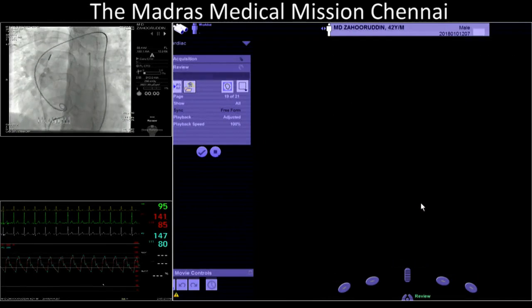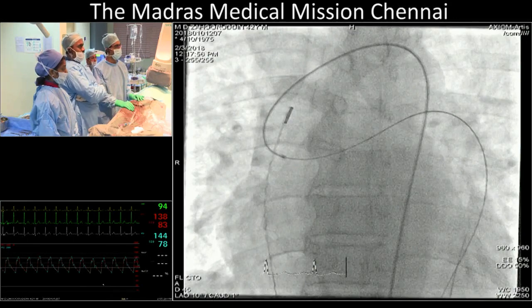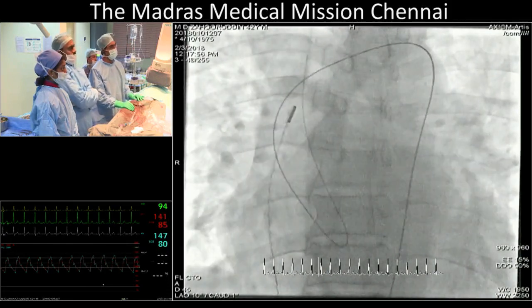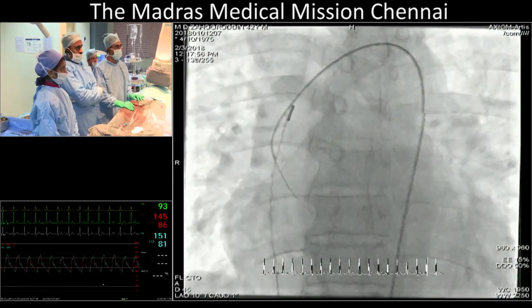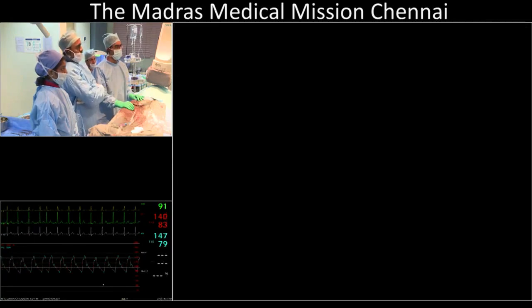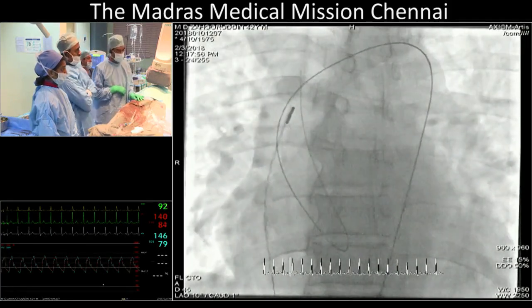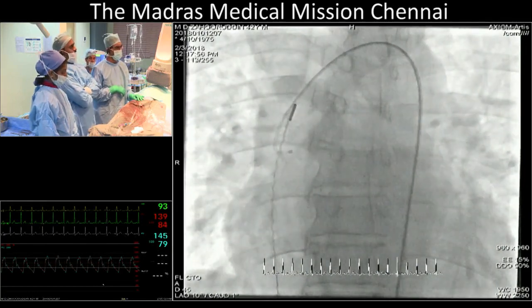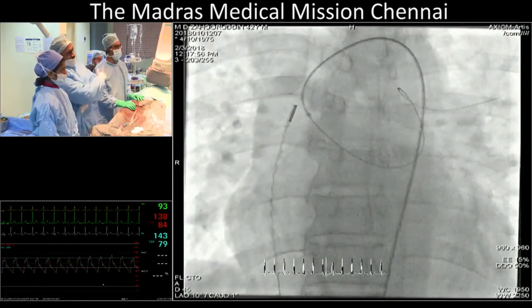We took an aortic catheter and dropped a wire into the pulmonary artery. The wire was very easily going through — you can see that is the wire crossing through the AP window. Once we got the arterial venous circuit established, we then proceeded.